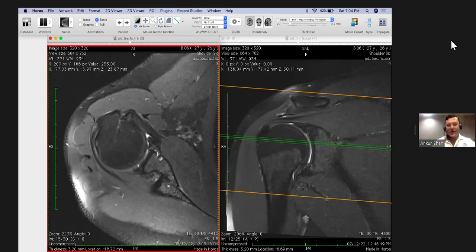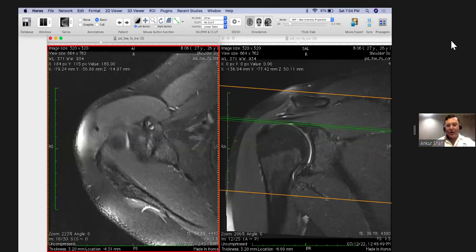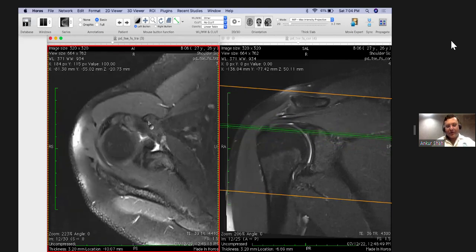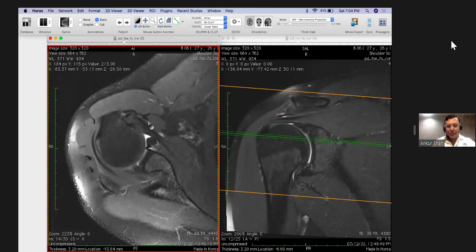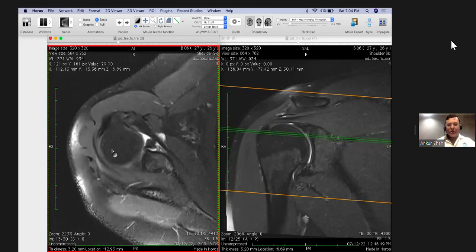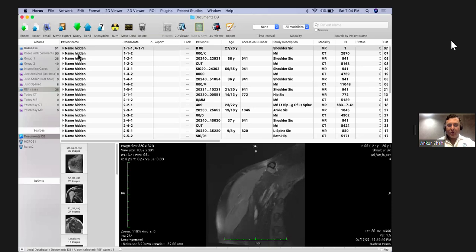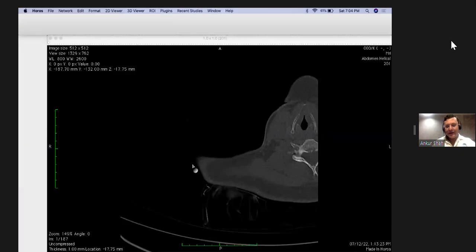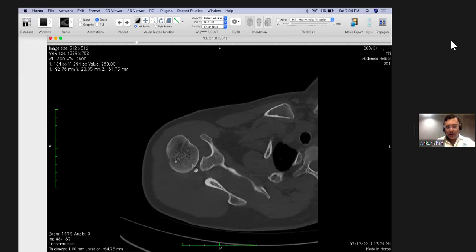That is the posterolateral aspect of the head of humerus superiorly, particularly when we look at the level of the coracoid. Here, if you can't see the coracoid, almost up to the level of the head of humerus, then at least see in the superior part or upper one-third of the head of humerus, you might see some areas of cortical flattening or depression. Again, when the changes are chronic, you may not see any marrow edema. Even sometimes when you have doubt on MR, you can take help of CT scan, and that might show you those subtle areas of cortical flattening better, like here.